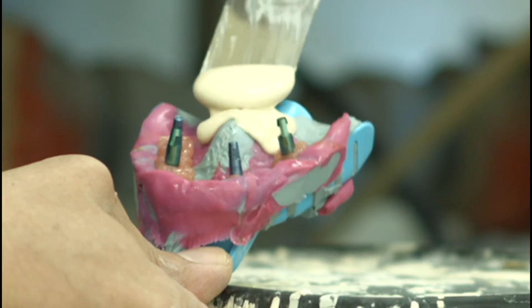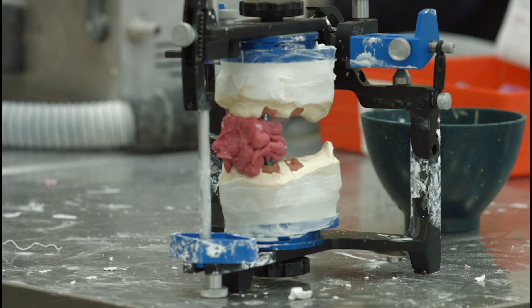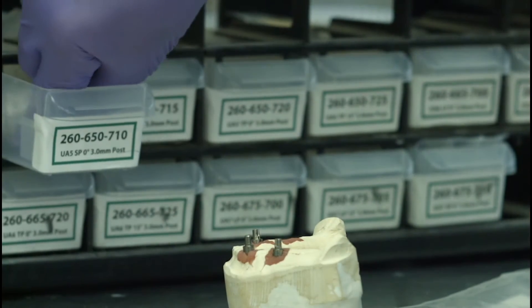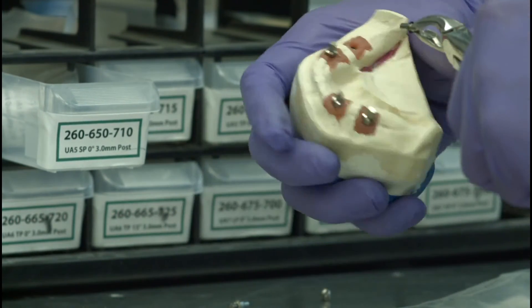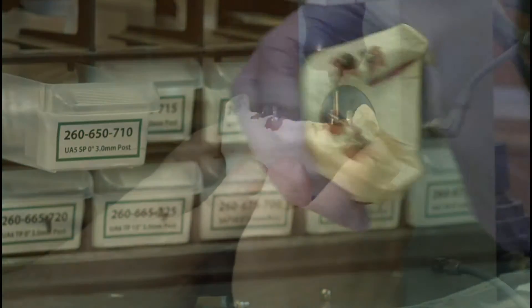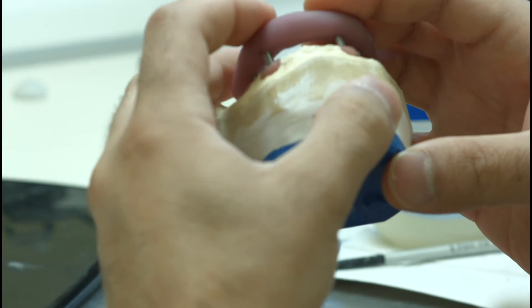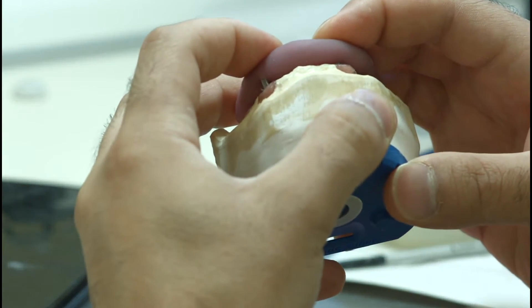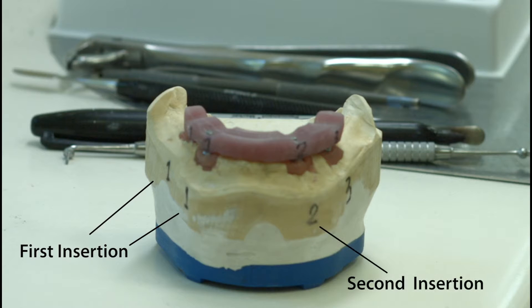The impressions were poured in dental stone and the resulting casts were mounted and articulated with the preliminary bite registration. The two blue and six green color-coded impression posts were replaced with appropriate straight or angled universal abutments. Final parallelism was achieved by modifying the universal abutments with two-degree comet burs. A pink light-cured resin jig was fabricated and numerically labeled to facilitate the appropriate sequential insertion of the parallel abutments into both the implant analogs in the model and the implants intraorally.